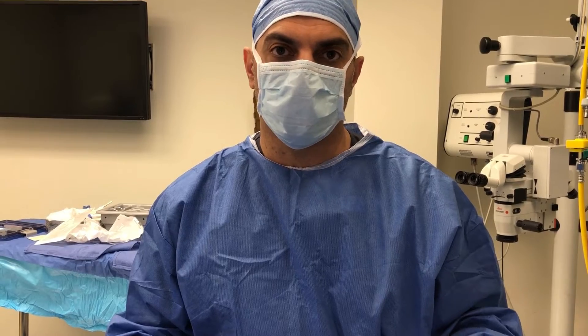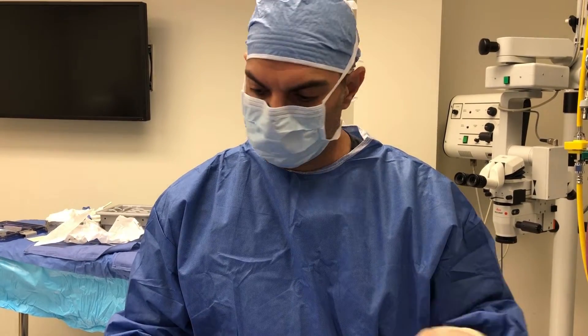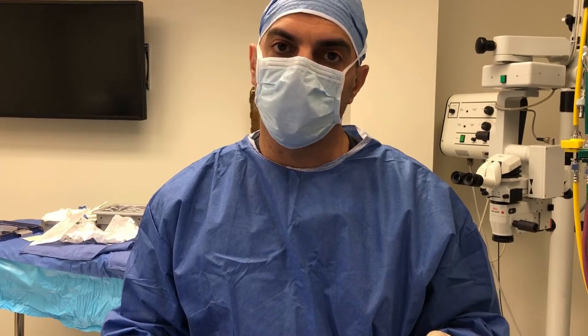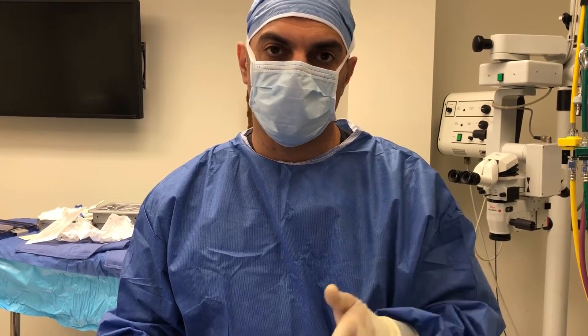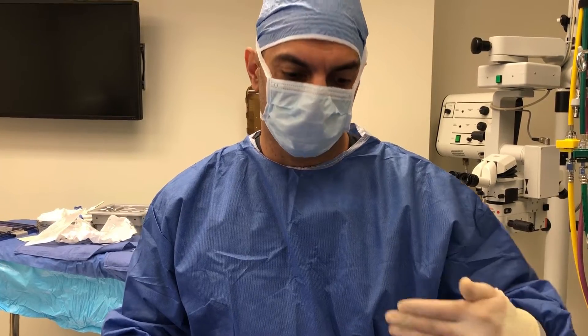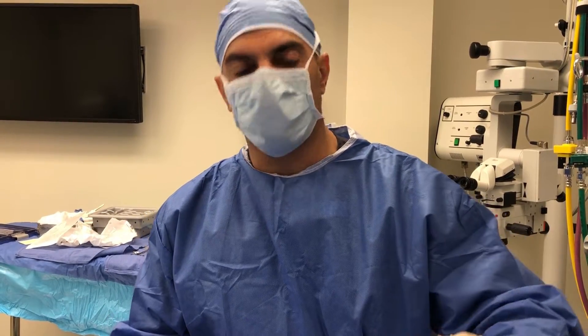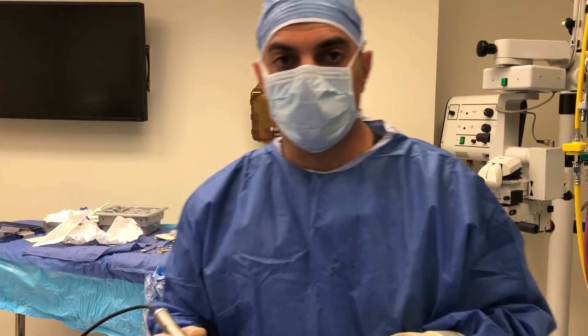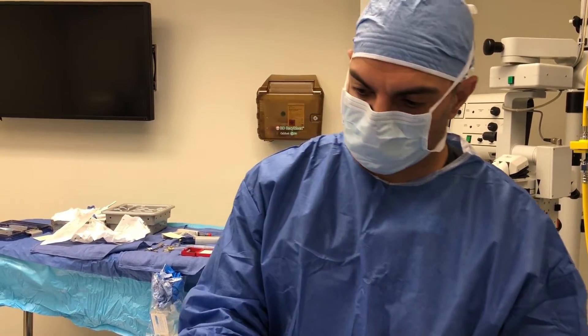There's skin resurfacing that is used for that. In this case, I like the dermabrator. People sometimes can use a fractional CO2 laser, erbium YAG laser — something to resurface the skin in a destructive manner and in a very controlled fashion. Some people even use a chemical peel. Today I'm going to demonstrate the dermabrasion, and here's the dermabrator device.